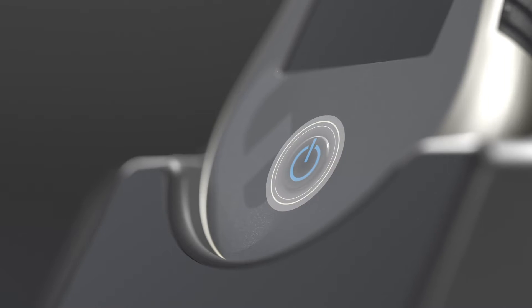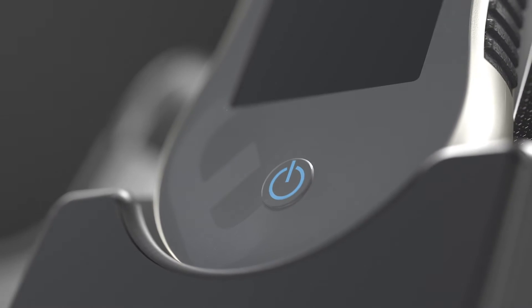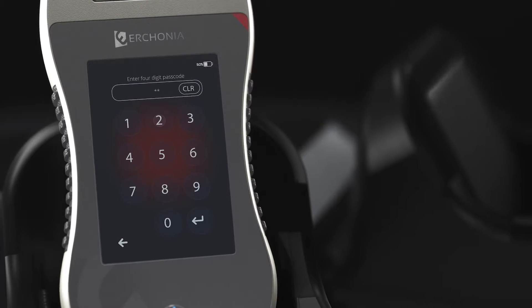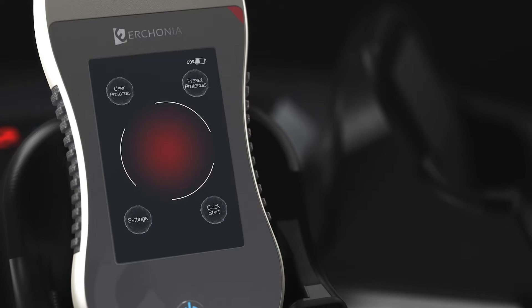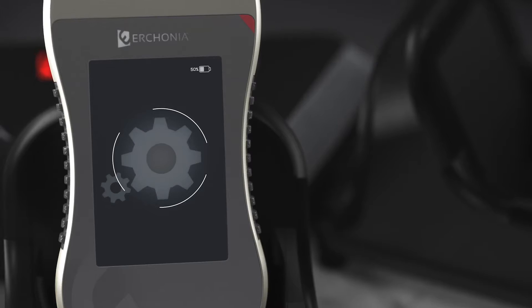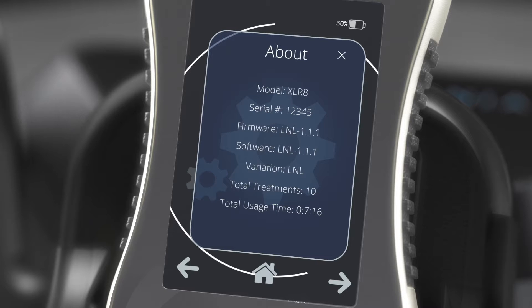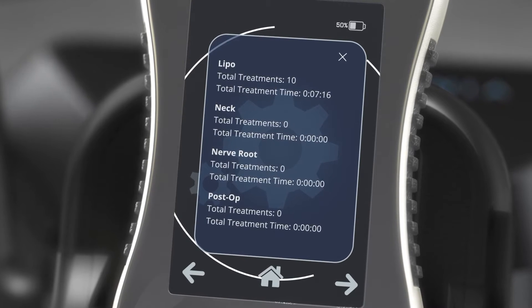To power on, hold the button for three seconds. The device will take about 30 seconds to initialize. At first startup, enter the default passcode 1-2-3-4. The main home screen has four touch buttons. Let's start with Settings. The About screen contains basic information about the device and if you scroll over it will show information about the various device protocols.